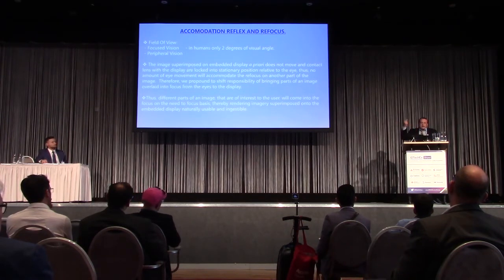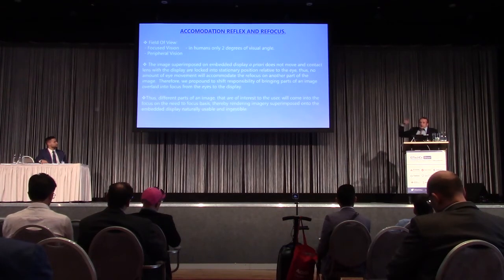I will move my eye. As I move my eye, the contact lens moves, the display built into the contact lens moves, and the image therefore goes here. I change the vector of my gaze to this location, and the timer appears to be here.